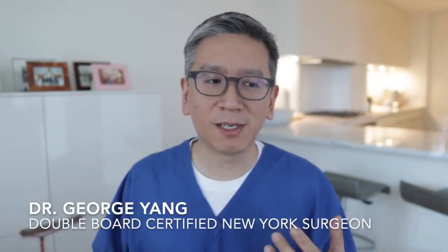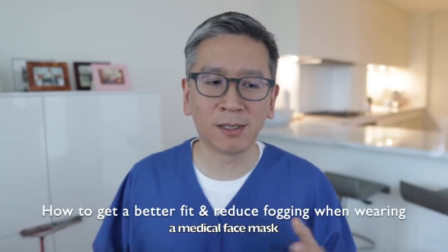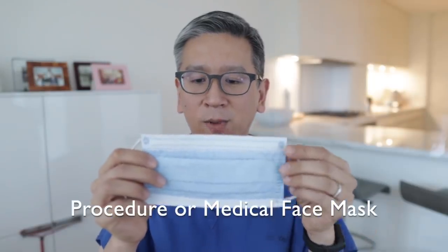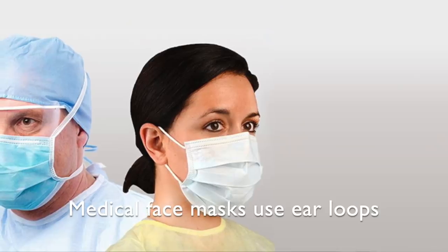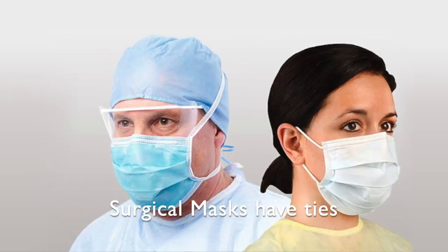Let's get into it. Before I get started, I wanted to say that this is a how-to video for medical students or nurses who are getting into the field, or people who are wanting to wear their mask a little better. This is a regular procedure mask. A procedure mask has loops. Surgical masks have ties.